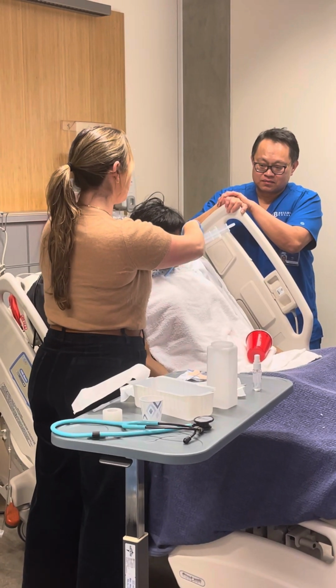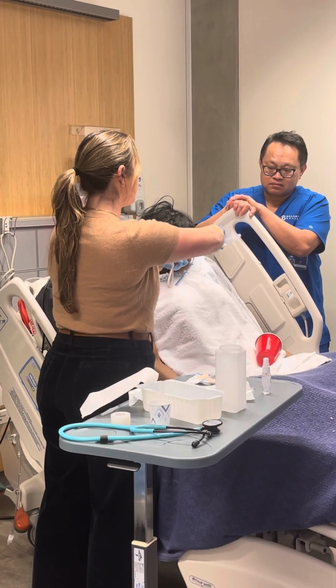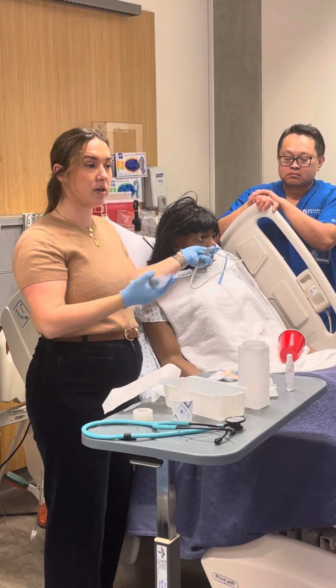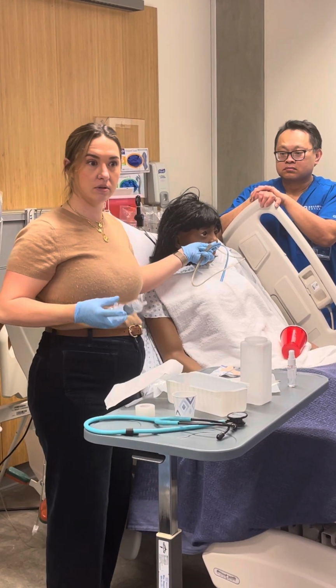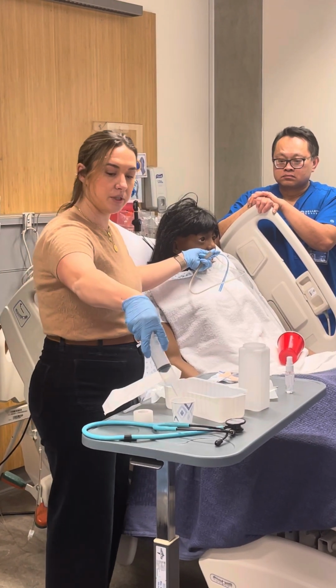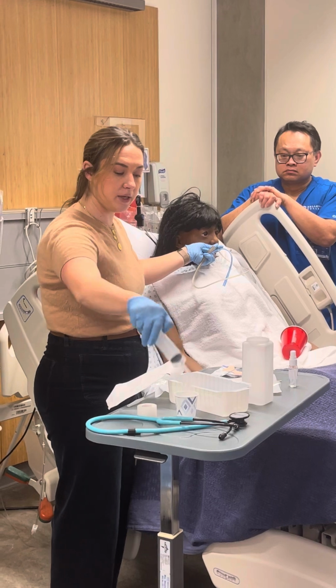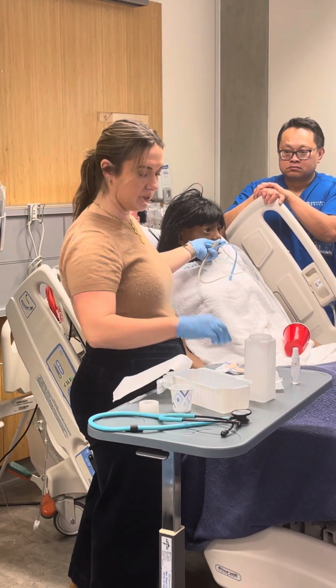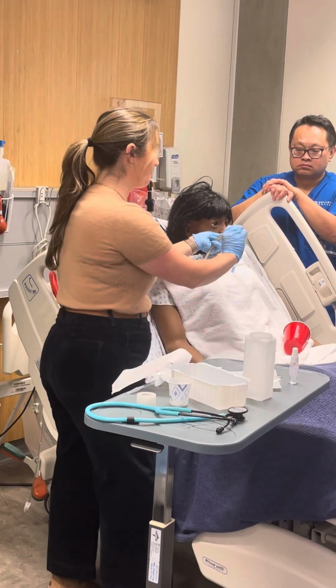So I have my hand stable up here. I'm not allowing it to come out, and that's because this is a really lubricated thing. If you let go, it's gonna start coming out. So I'm gonna check my aspirate. Okay, this is acidic. I'm gonna secure.